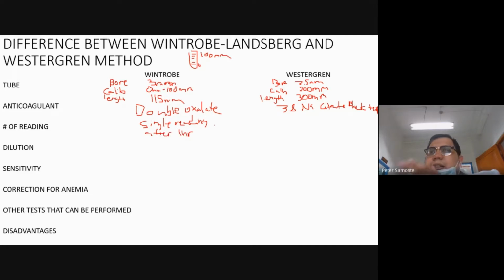So let's say nag-start ka ng procedure mo ng ESR ng 8 a.m., you would be reading the final result at 9 a.m. And then sa Westergren naman class, 2 readings. So sabi ko kanina, di ba, pwede siya ng 2 hours. So pwedeng after an hour or after 2 hours. Depende.